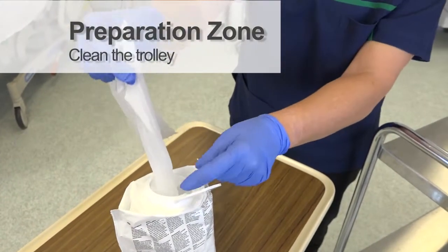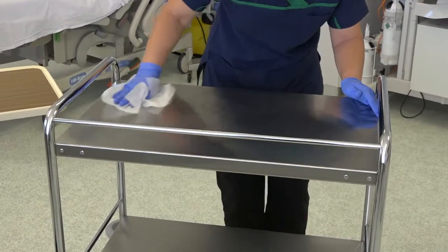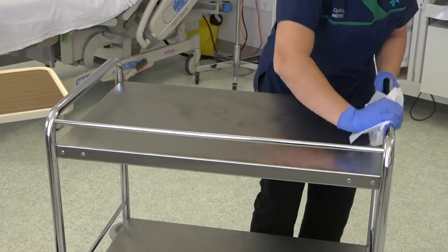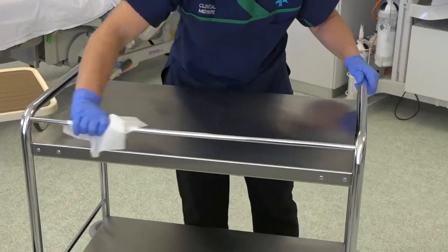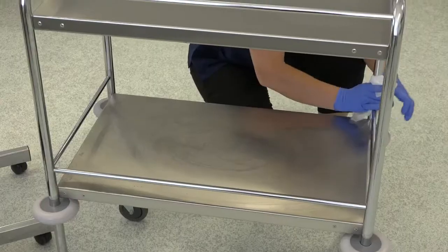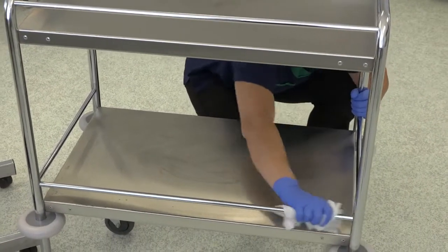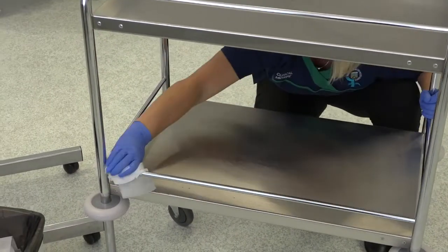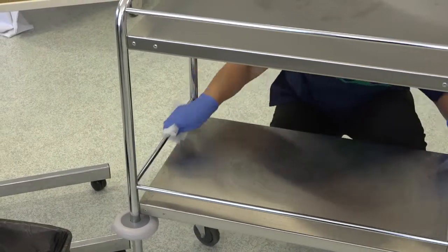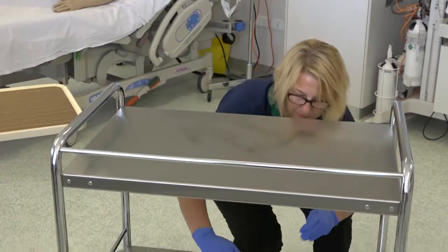Clean the trolley, beginning at the top and cleaning from the inside to the outside, continuing to the legs and then finishing with the bottom.